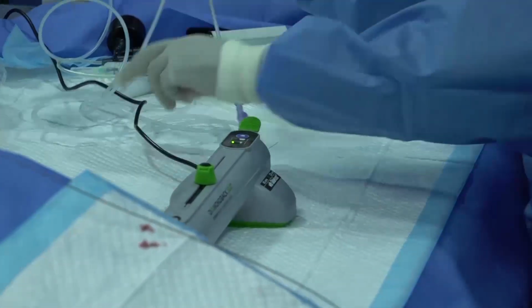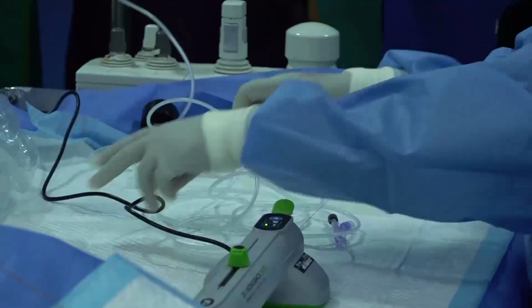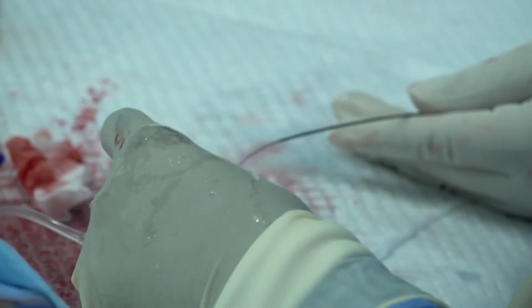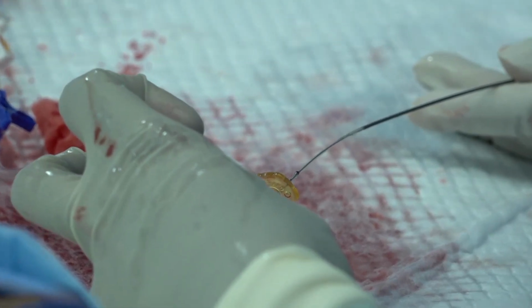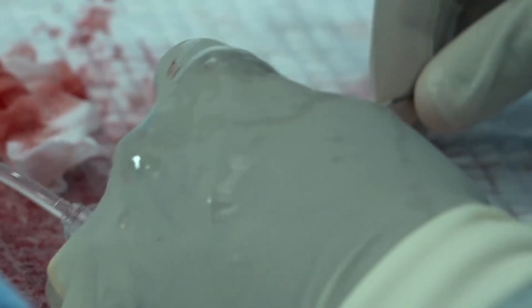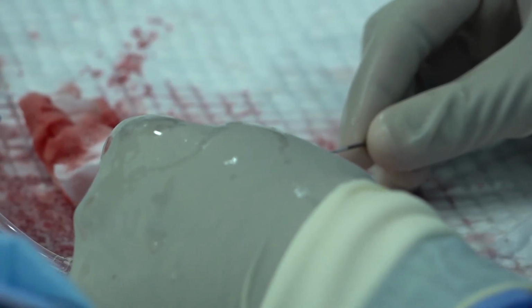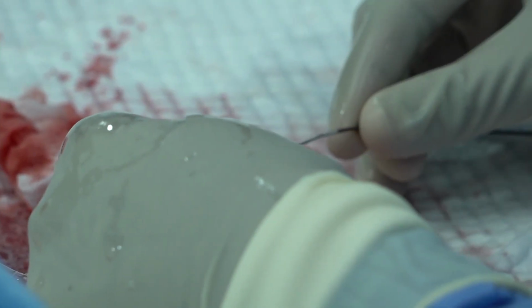Okay, now we'll check all the parameters. First thing, the flush. Can you focus on this one, please? This particular area. Okay, it's focused. Now we are seeing the saline flush flowing well. Now we'll check if the burr is working well. Can I start? Yes. The brake. No, sorry. This is important.